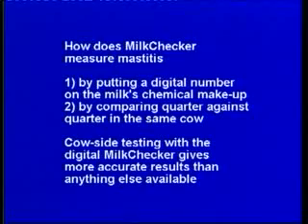Test cows straight after calving and at any stage during the season to keep somatic cell counts under control. How does milkchecker measure mastitis? First, by putting a digital number on the milk's chemical makeup, and second, by comparing quarter against quarter in the same cow.